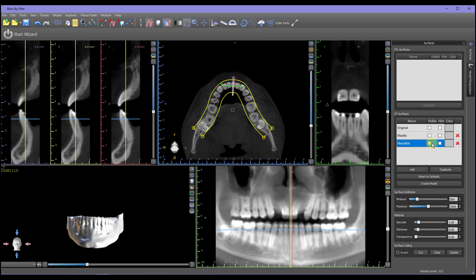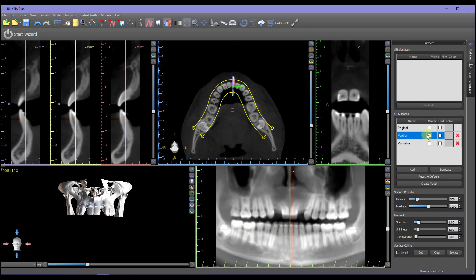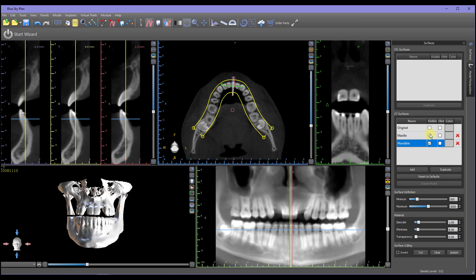Now each arch can be made visible as necessary, and in essence, toggled between the two arches.